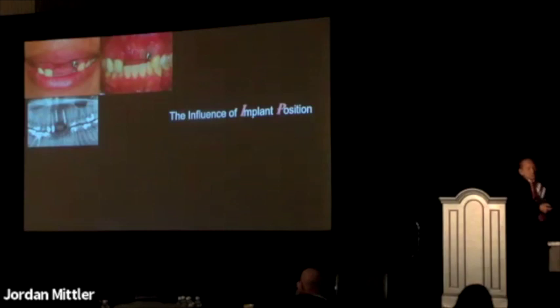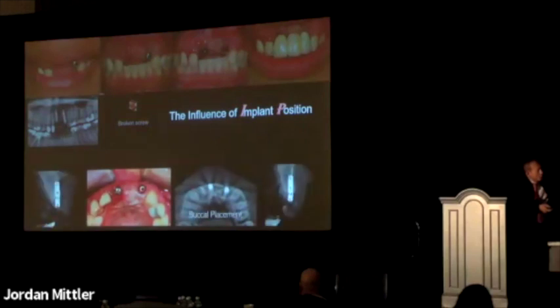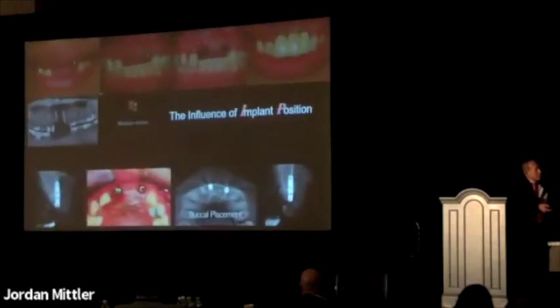Here's another patient. The bridge came off because the screw broke, because the connection was weak. I didn't place the implants, but I took the screw off and put the bridge back on. You can see the profound effect of just the position of the implant. This particular patient had plenty of keratinized tissue. The patient also had plenty of bone, because on the CT scan you can see the bone on the crest of the implant. Whenever you can see bone on the crest of the implant, that means there's a lot of bone. This is entirely positioning of the implant. It's not mucosa that's there. The tissue is thick, and there is bone. But because the implant is just a little bit buccal, you see how it affects the soft tissue and the length of the restoration.